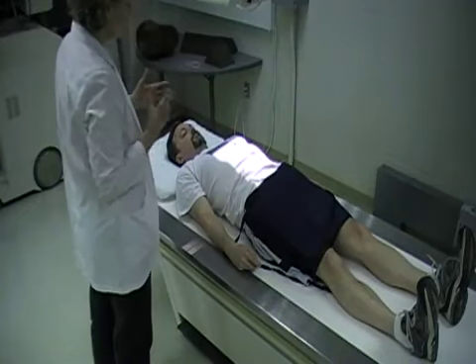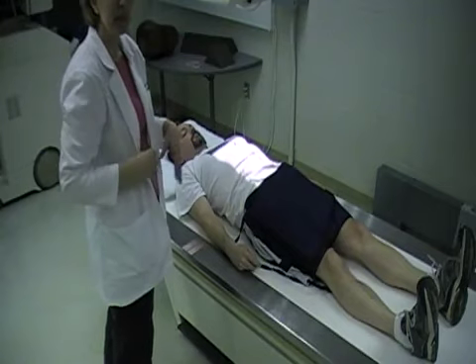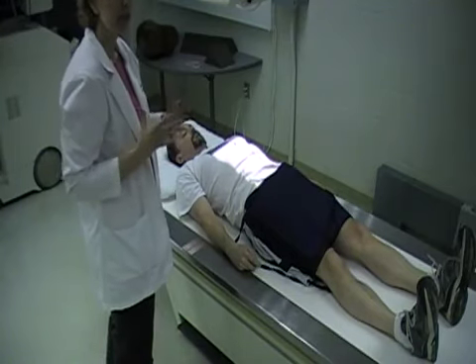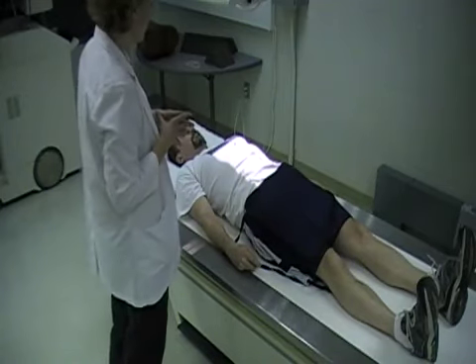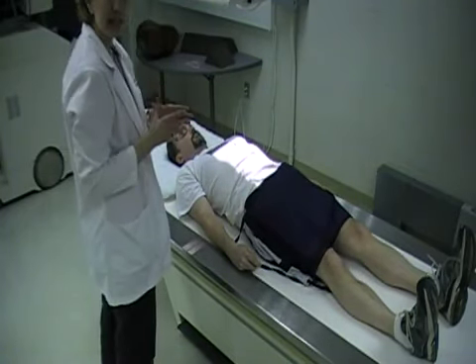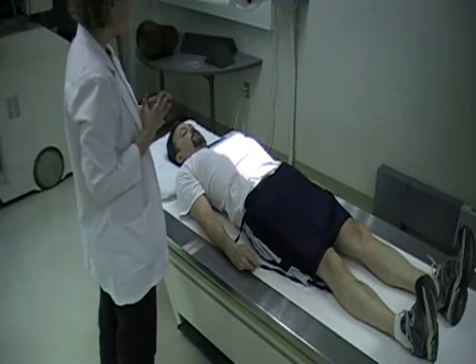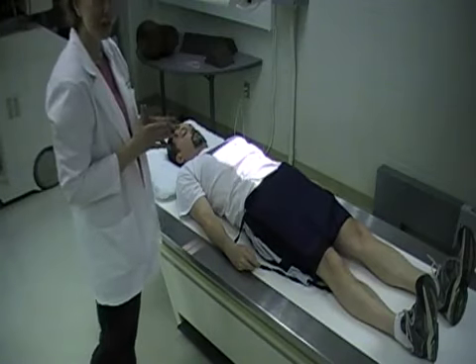In this case, with the large image receptor, we're not only getting the stomach, but we're also getting a portion of the small bowel. So we're just seeing more territory in the abdomen when we use the larger image receptor. This is our AP image, and you would take this on expiration, so you have the patient take in a breath and then blow the breath out and hold it out, and then you would take your exposure at that time.